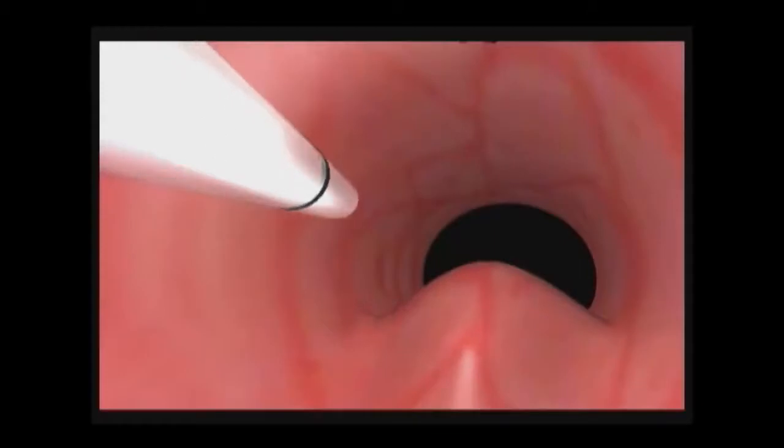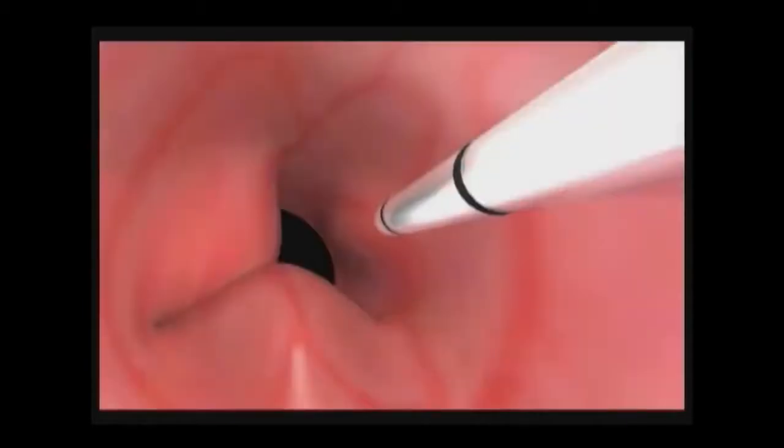You will use the second 2.5 milliliter macroplastique syringe to create boluses in the 10 and 2 o'clock positions. Each of these boluses will hold approximately one half of a syringe, about 1.25 milliliters, of macroplastique. These boluses are created following the same tissue tunneling and injection procedure as demonstrated with the 6 o'clock location.